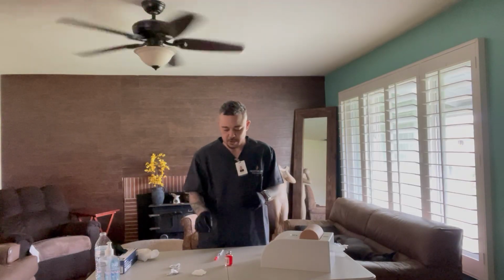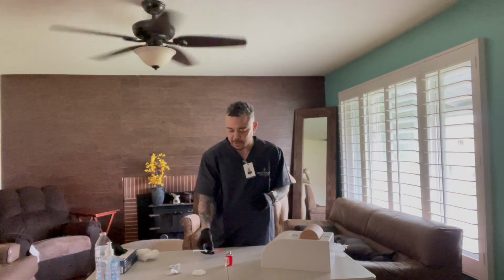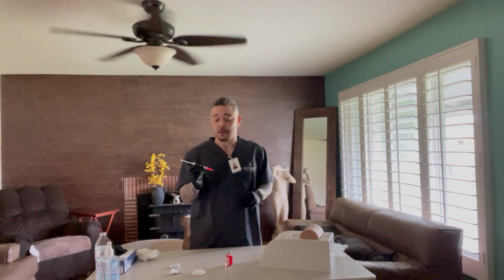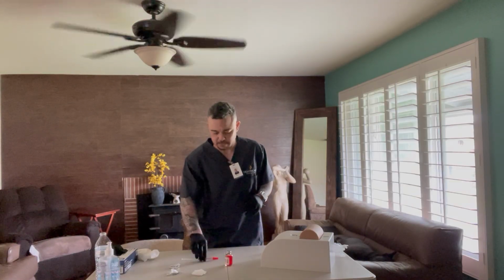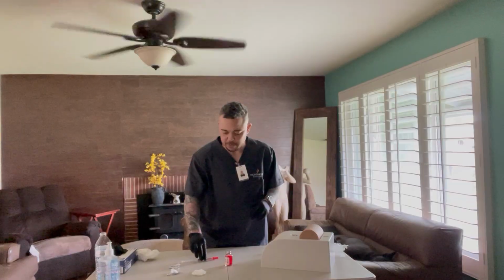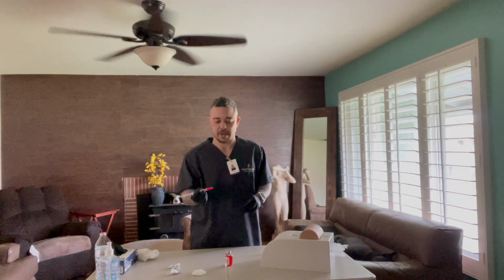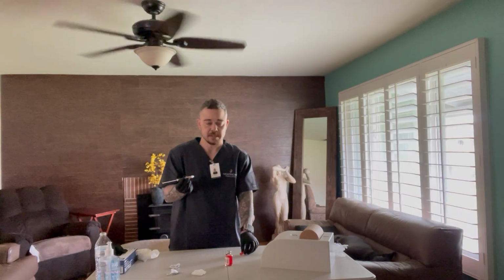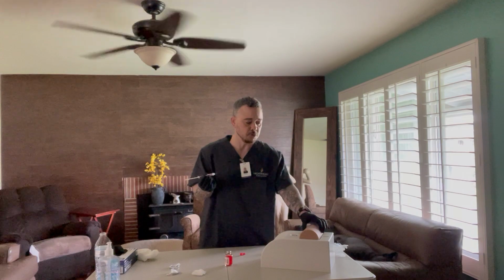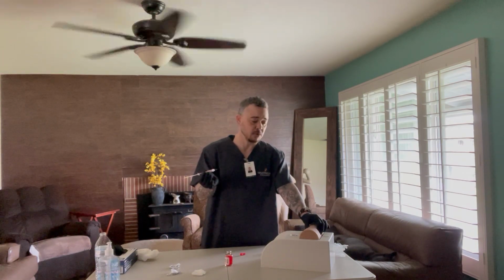While that's drying, I'm going to use just my thumb and my 2 fingers and pick up my needle, using 2 fingers, kind of like a dart, okay? And I'm going to take the top off. Since this is heparin, I'm going to pinch the skin, 1/2 inch skin fold, okay?